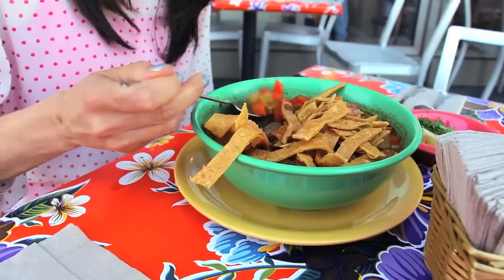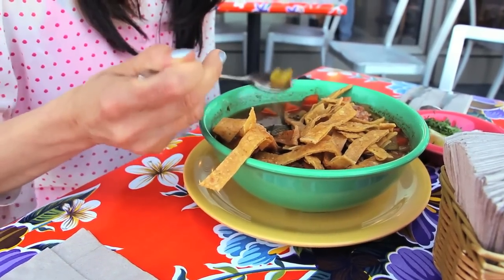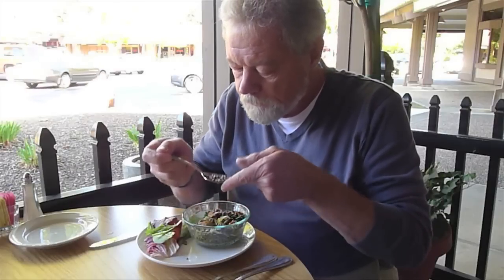Mealtime brings people together. It's more than a time for nourishing the body — we nourish our spirit and our relationships. But tremor, whether from essential tremor or Parkinson's disease, takes away from this experience, forcing people to focus instead on the basic task of eating.